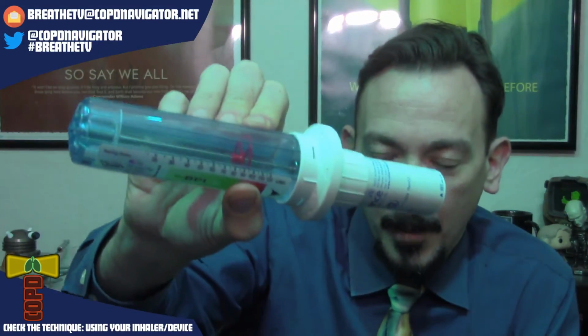Like so. We want to make sure that you're doing a nice sharp inhale, because you want to hit what we call the peak inspiratory flow very fast, so that you're breaking up that powder instantly and capturing it into the flow down into your lungs. Now, we see on this particular resistance, I, having relatively healthy lungs, am able to generate, we've got our little indicator there, about 95 liters per minute of airflow.